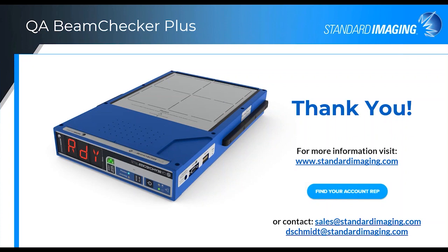Can the device automatically distinguish between FFF and non-FFF beams? And the answer is not at this time, because the device is based off of the energy. So an FFF beam and a regular beam would have the same energy signature, and the device would be confused. So we don't want that to happen. So the simple workaround for that is, remember that I told you the device has 9 different room capabilities that you can store in it.